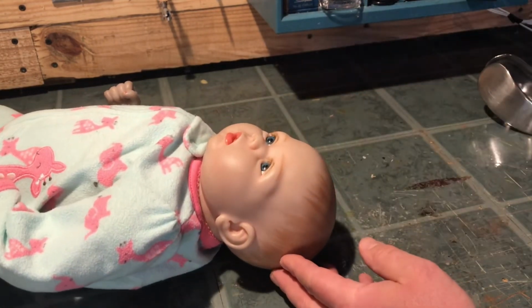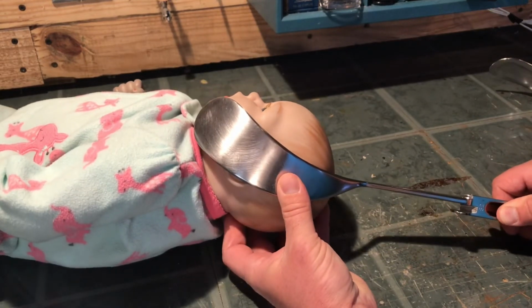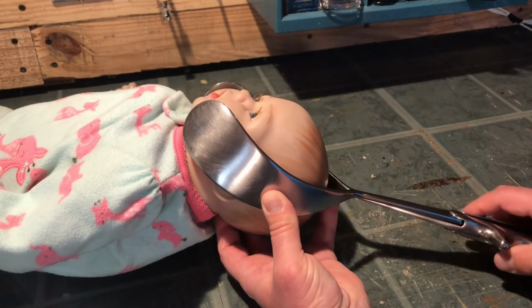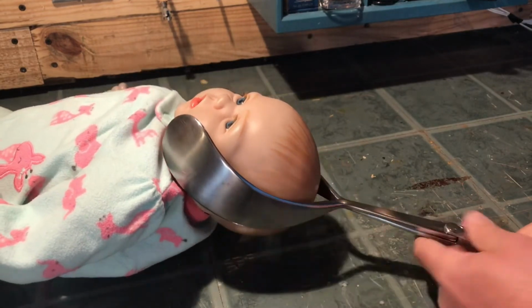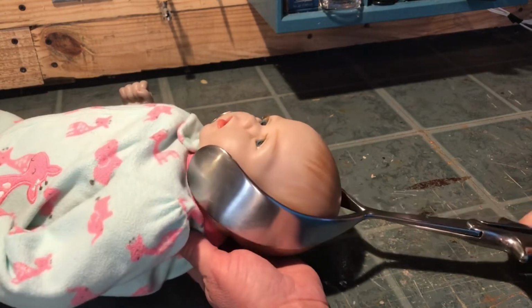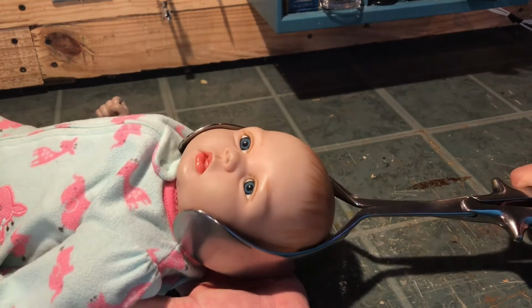Now I'll show you what it looks like to apply these delivery forceps. They're going to come in and go around baby's head like so, and around the cheek. Now these will come in from both sides, and then the instrument interlocks at the handle, and they're able to hold the baby's head in position and gently pull the baby through, assisting with that vaginal delivery. Now as you can see, it's pretty clear why there's risk for injury there.